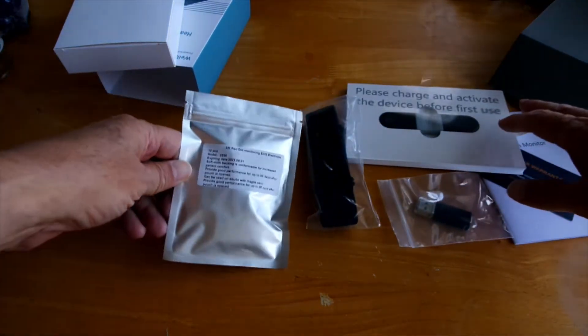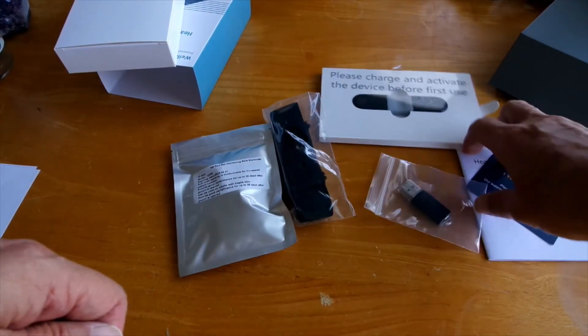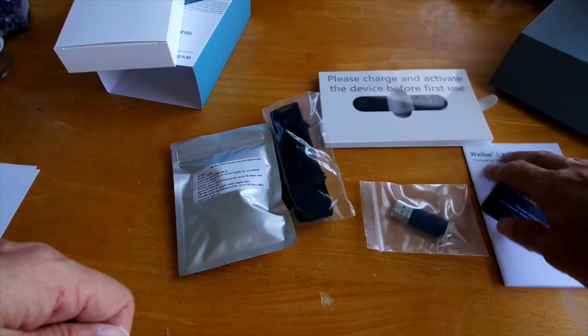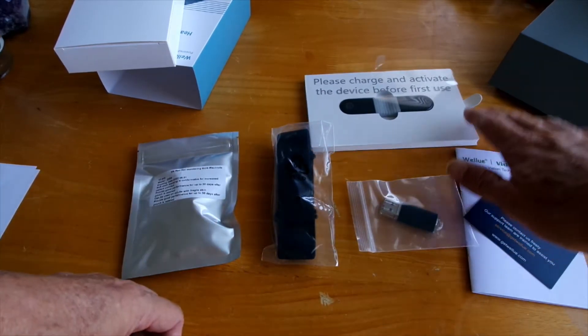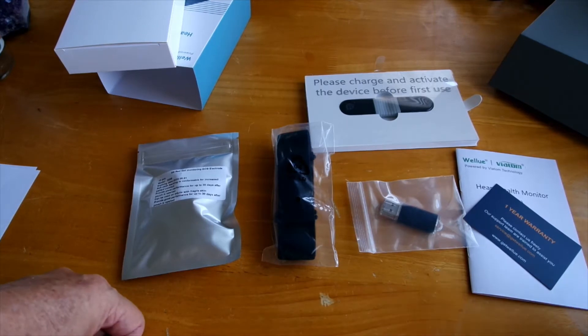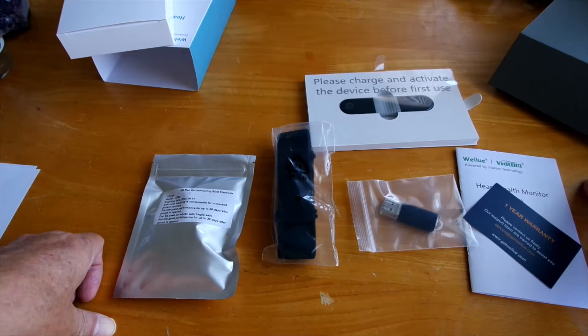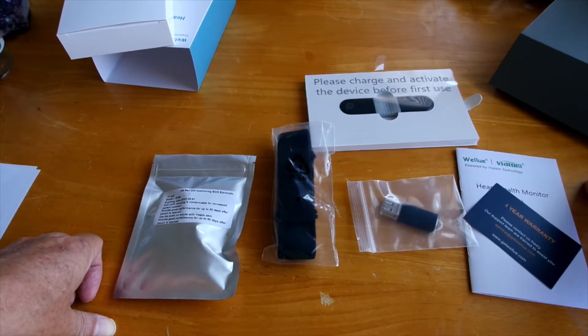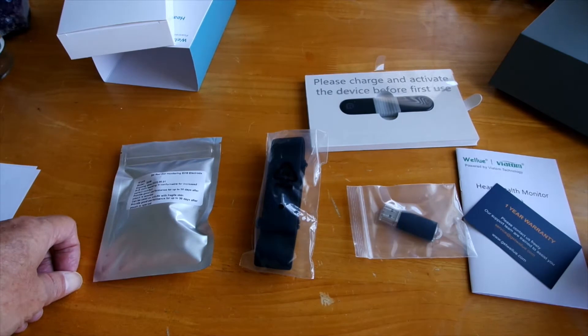There's also a package of electrodes if you choose to use those versus the chest strap. This product is pretty cool because its goal is to have a report that you and your doctor can use to see how your heart is doing. It has an artificial intelligence analysis that checks over 104 heart issues in 16 different categories, and the AI algorithm is FDA-approved.